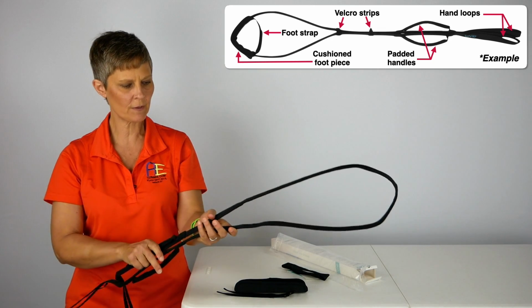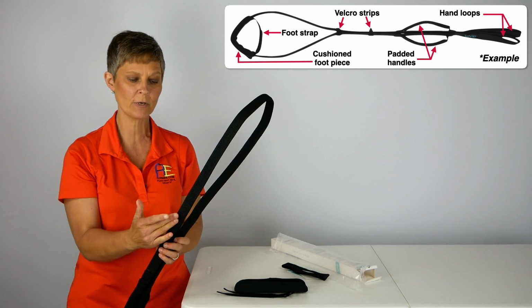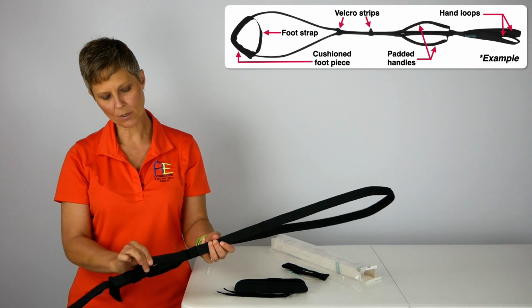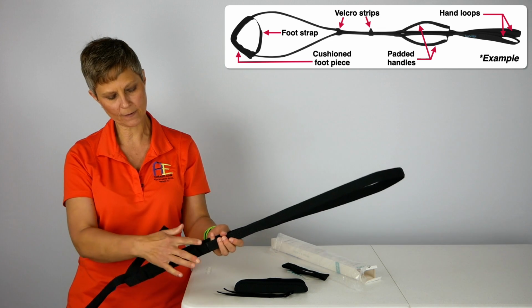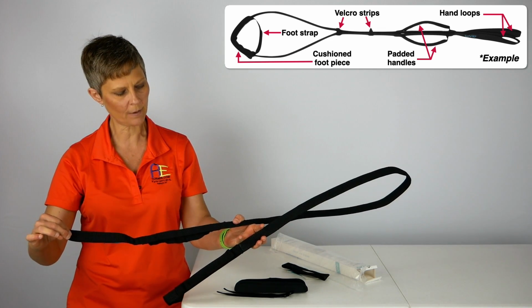Now, as you notice, this is made of nylon webbing. It's got an aluminum flat piece of strip inside. We've got two sets of handles up here. These are padded a little bit right here on the side of the strap, and then you've got some soft straps up here at the very top as well.